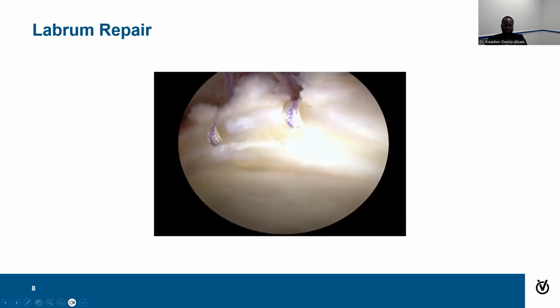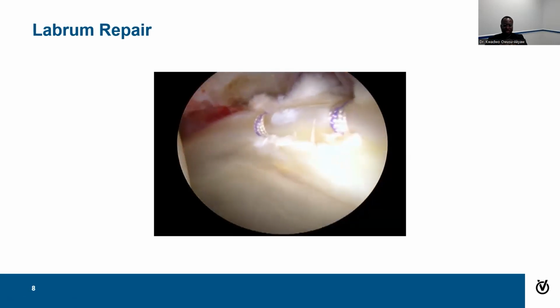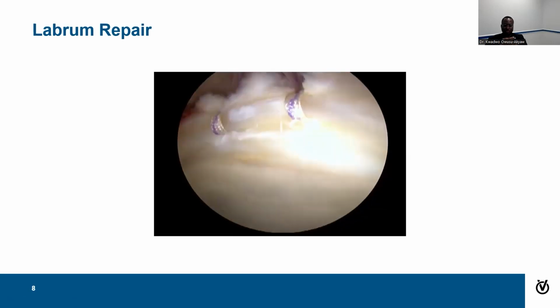So in this case, we put two stitches side by side, and then here we are, having fixed that labrum back to the bone. Good. All right, we go to the next slide.